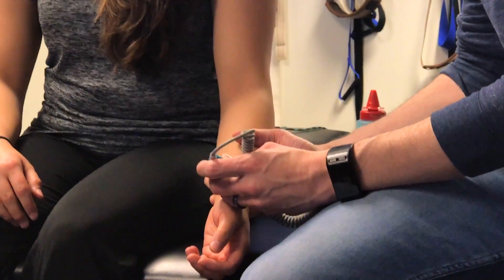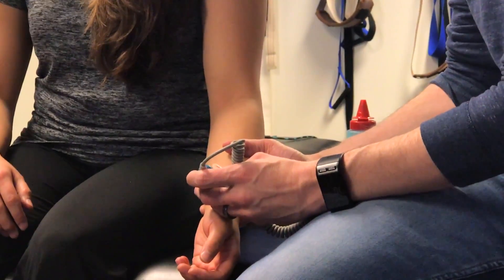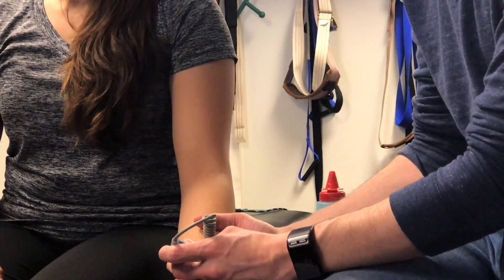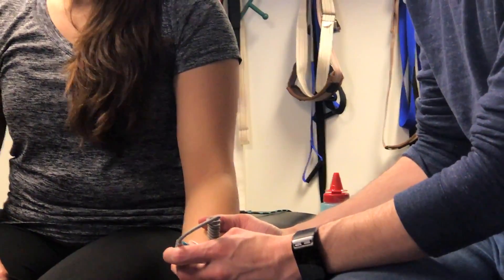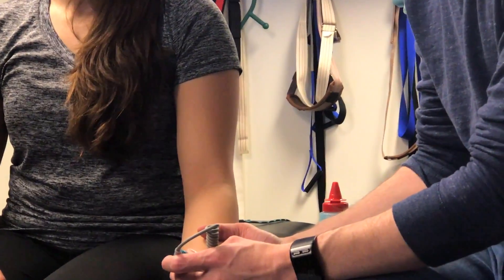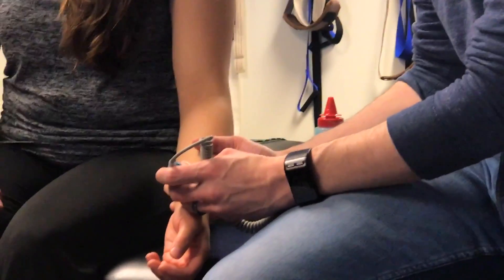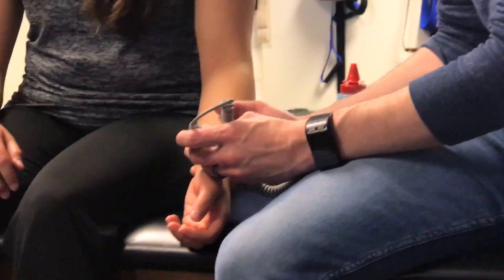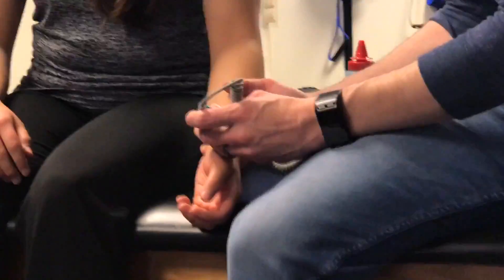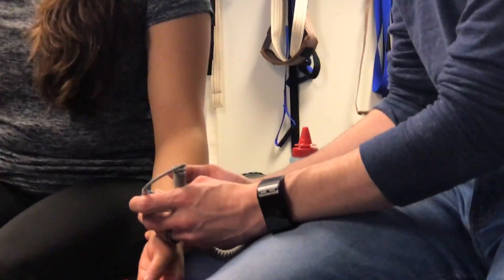What I also like to listen to briefly in the beginning for baseline is whether or not the pulse is regular. If you looked at an EKG — remember the P wave, QRS, R wave to R wave — the peak-to-peak interval will have some variability, and that's actually a good predictor of cardiovascular health. So it's not always going to be exact, but you don't want it to be.